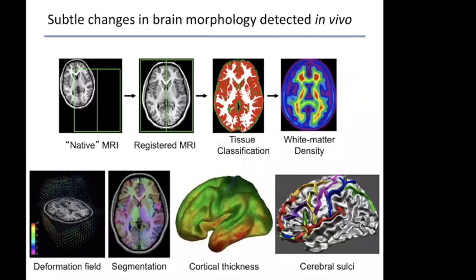But our ruler doesn't really exist in structural MR, and you have to infer the measurements from the images that we acquire. This means that we need to take our image from the scanner and pre-process it in different ways, so that at some level, whether at the voxel level or at some reparameterization of the image, we're able to deduce measurements that we can use for statistical analysis.